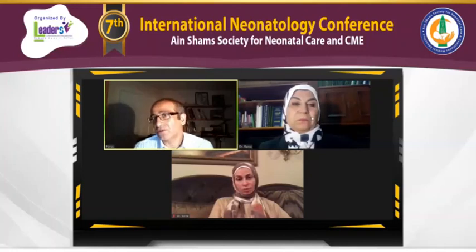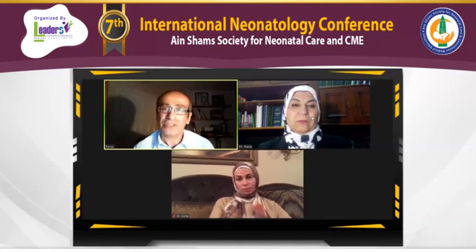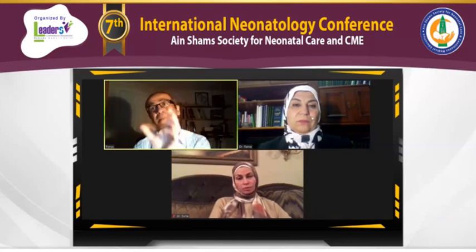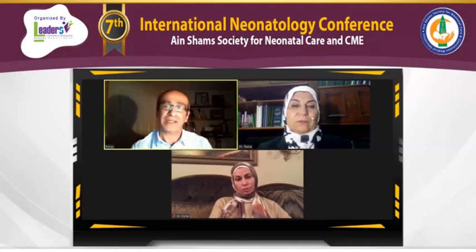Problem for you. So you'll notice the pressure will come down, the tidal volume should stay the same. The only things that can change with surfactants in those situations is that because your lung compliance changes and your time constants change, you have to make sure that you're completing inspiration, completing expiration. Because sometimes if you're on a very fast respiratory rate, say 80, and that was plenty, that was your inspiratory time and expiratory time was so quick, you were completing your cycles.